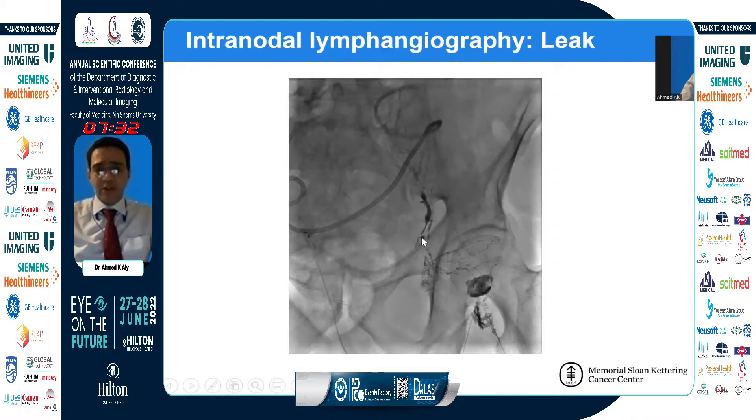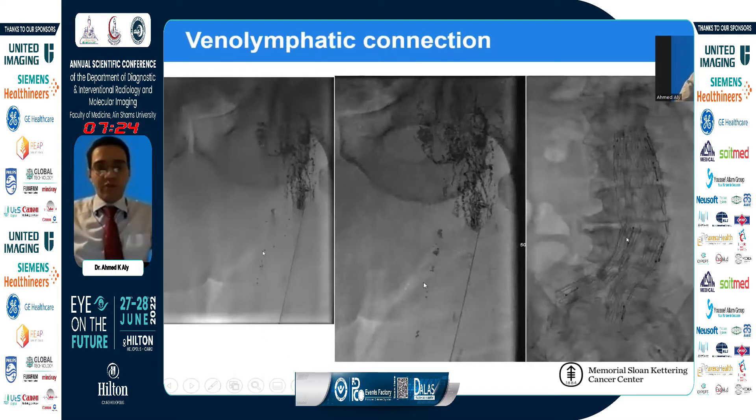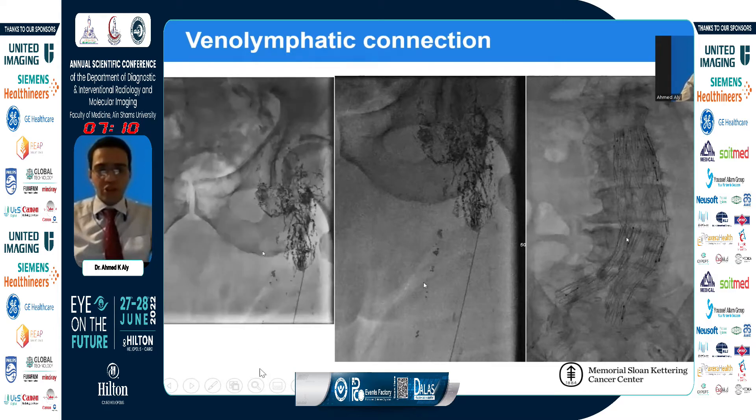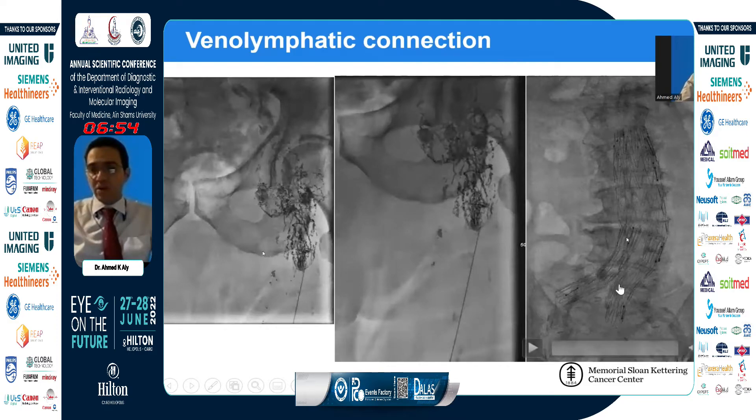This is another example of lipiodol accumulation outside the lymphatic system, consistent with a leak. Sometimes we encounter venous-lymphatic connections — connections between the lymphatic and venous systems. When you see the lipiodol moving in a weird direction or speed and accumulating into a tubular structure, you suspect it's entering a vein. You confirm this by venous augmentation through calf muscle compression, which shows the contrast flowing consistent with venous flow.